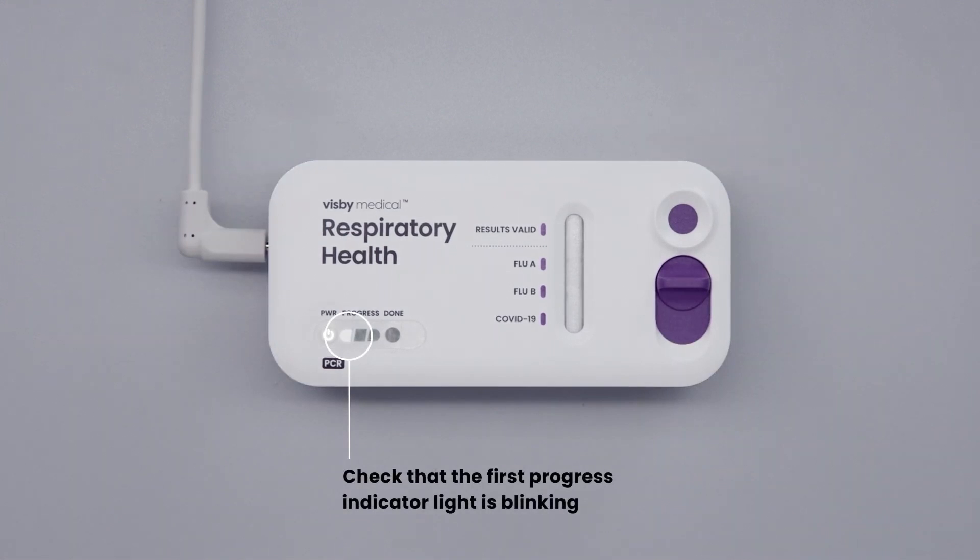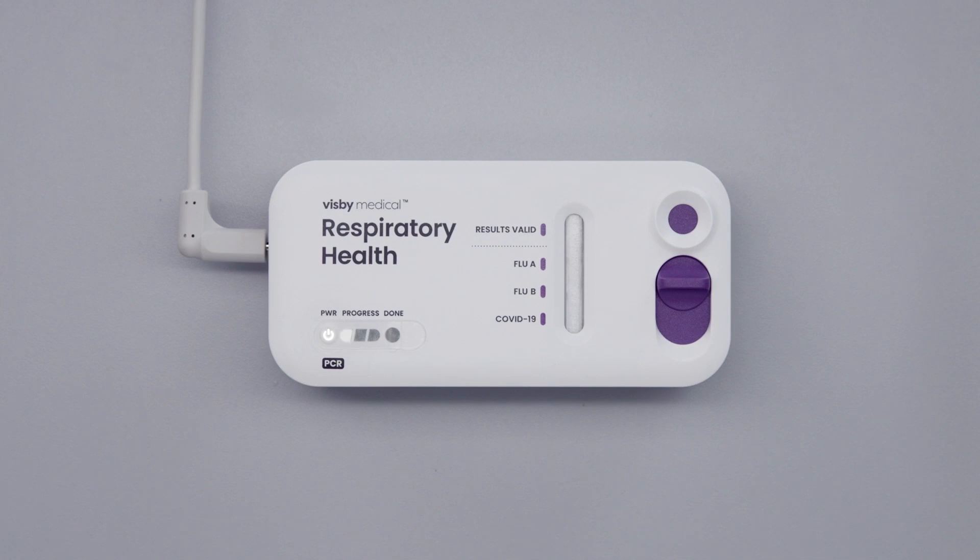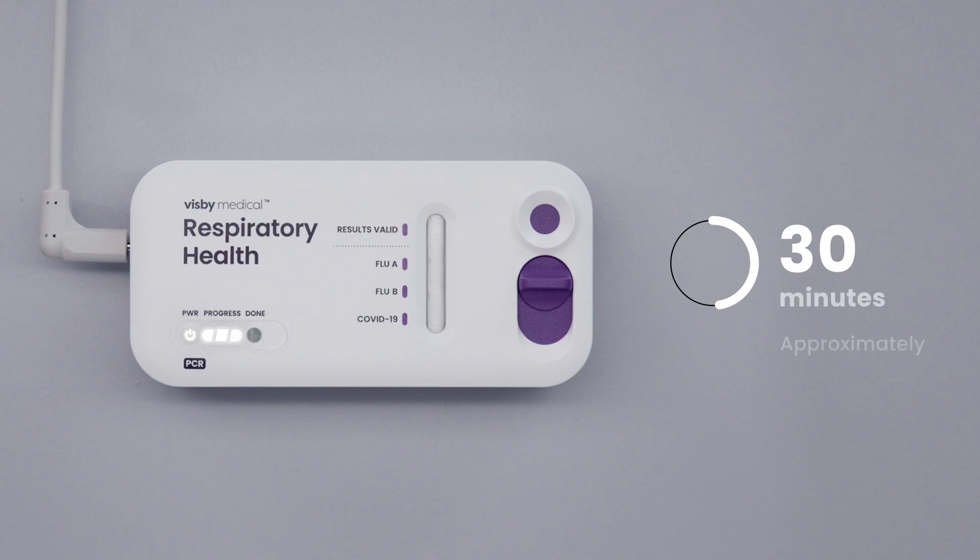Slide the switch closed to start the test. Check that the first progress indicator light is blinking. Progress indicator lights will initially blink and then become stable as the test progresses. Do not move the device while the test is running. Once the test is started, the results will be ready in approximately 30 minutes.